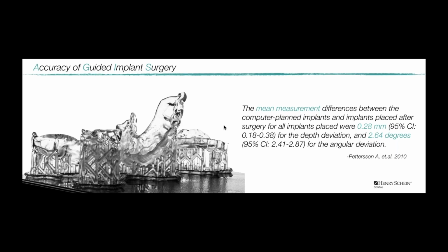Now, when we say go guided, today that could mean static resin-based guides. That can mean dynamic navigation with a camera-based system, or it can mean robotics. We have three main mechanisms of guided surgery today. We do all three in my practice, and the reality is all three have similar results, where we can place implants bodily in a vertical, apical to coronal dimension, in a bodily lateral buccolingual, mesiodistal position within a couple of tenths of a millimeter and within angulations of about 2 degrees, right?